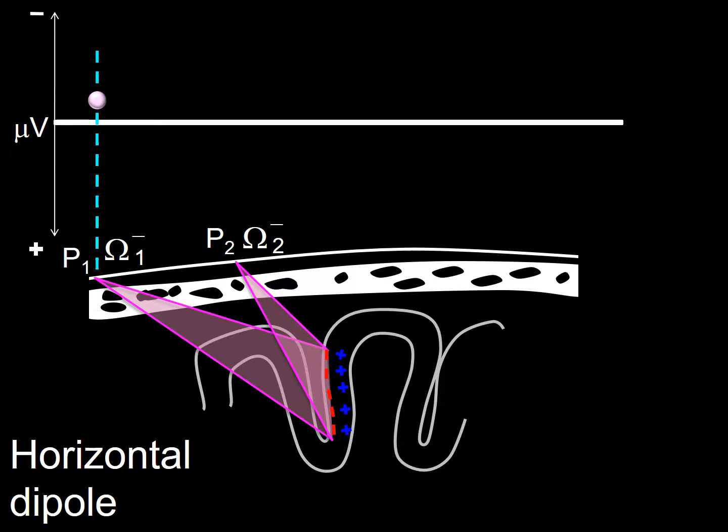I am going to do the same exercise with P2. Let's just say that the amplitude of P2 is bigger than the amplitude of P1 and that both are negative. This is so because on the balance, the increase in amplitude resulting from a shorter distance is enough to compensate for the loss of amplitude due to a narrower angle. I will therefore place a point to reflect the increase in amplitude at the position corresponding to P2 in the voltage line.